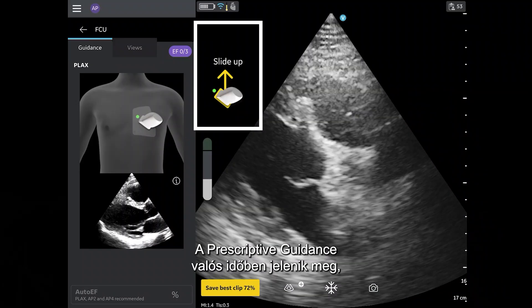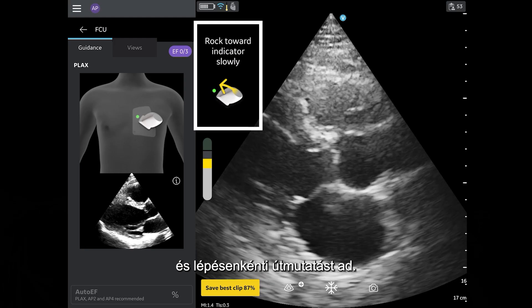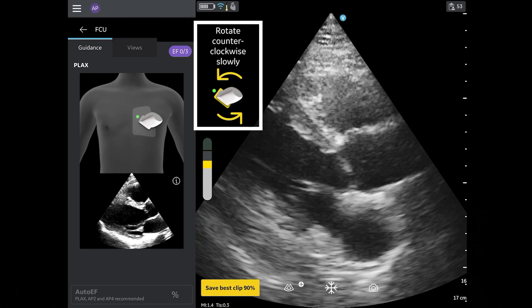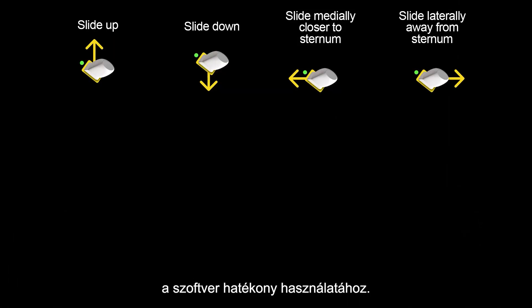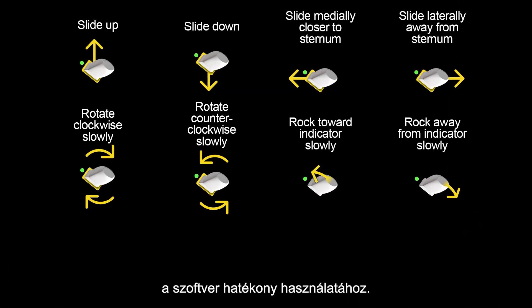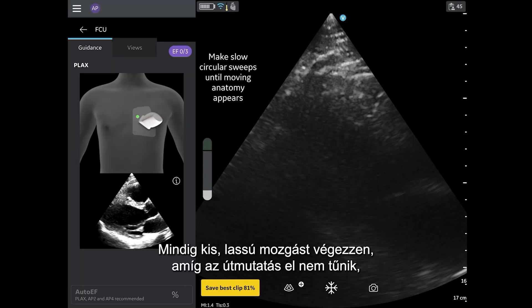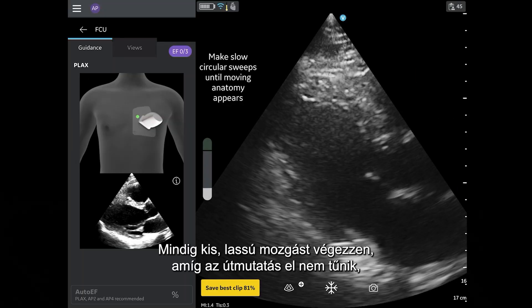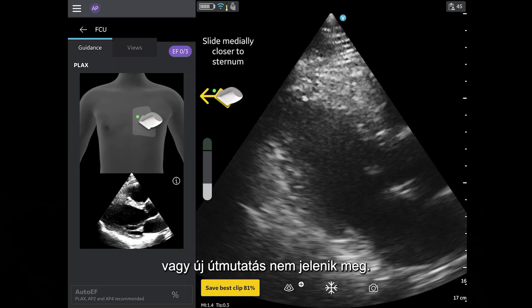Prescriptive guidance appears in real-time, providing turn-by-turn guidance. Understanding how to make these movements is crucial for effective usage of the software. It is important to note that all guidance movements are to be made in relation to the patient. Always make small, slow movements until the guidance goes away or new guidance appears.